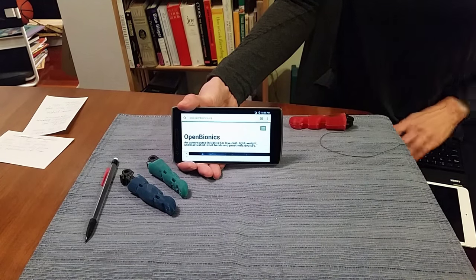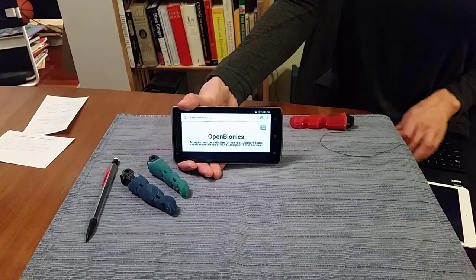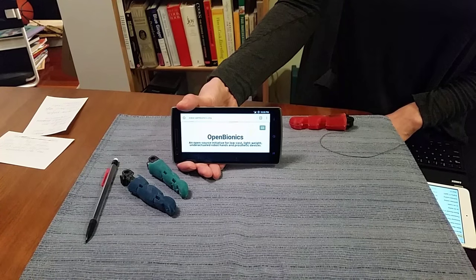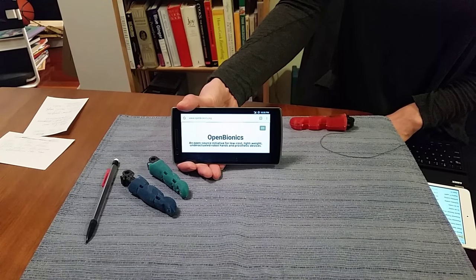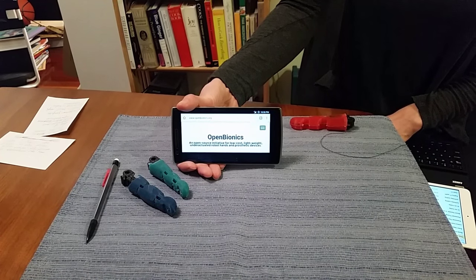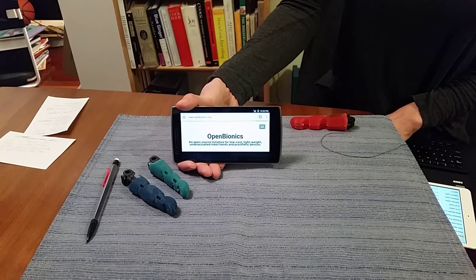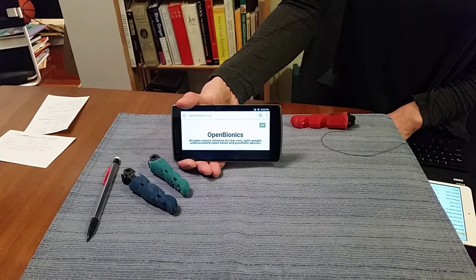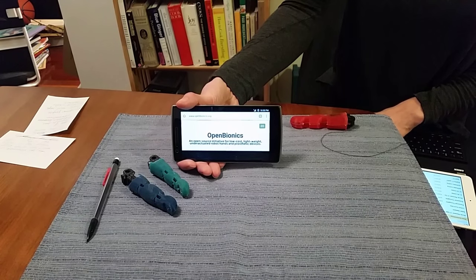This technology can also be used to store information about the owner's contact information, information about the production and maintenance of the prosthesis, as well as user preferences including favorite radio stations, navigation routes to home and work, mobile phone settings, and data to facilitate one-touch transactions in retail settings.